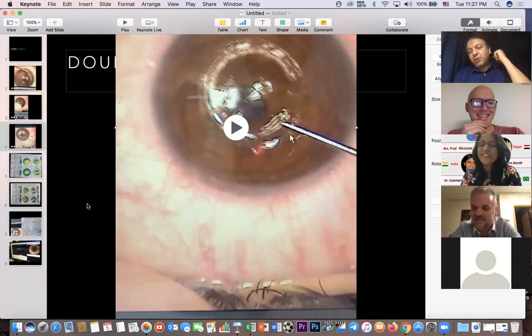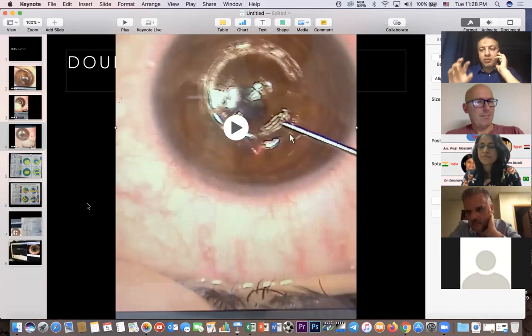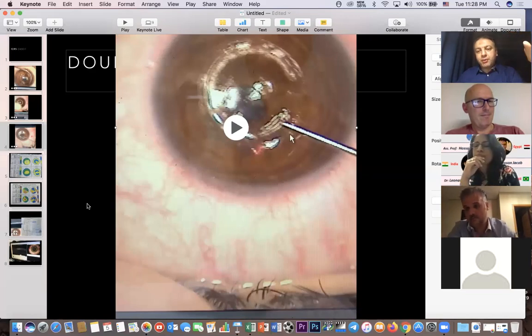I'm sorry. So I will give you the last question. When you have a patient with high cylindrical error, even -5 cylinder, but can have very good vision, 6/6, with the glasses, and another patient with a smaller cylindrical error, even -2, but the best corrected is less than 6/6, maybe 6/12. Will you go for intracorneal ring implantation for the small error, and for the high error, even though this patient with spectacles can see 6/6? Or will you advise this patient to stay on the spectacles without intracorneal ring? Is my question clear? Yeah, I get what you're asking.